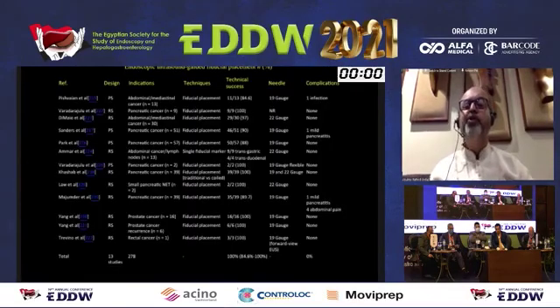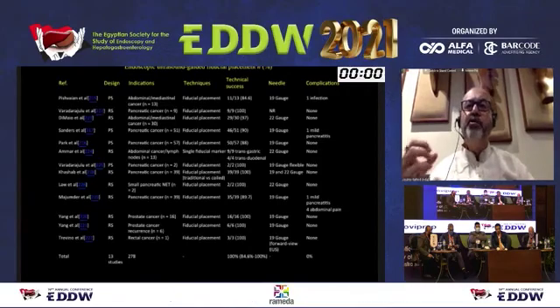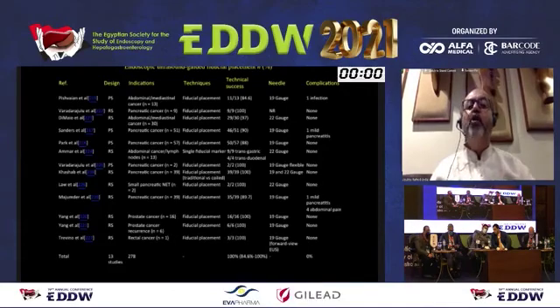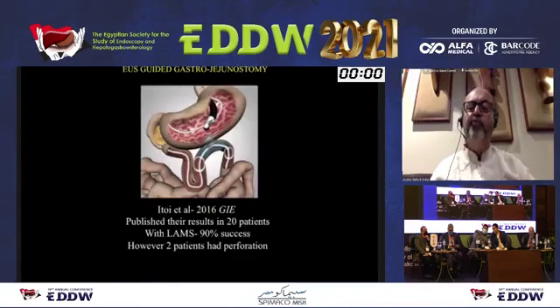Coming to fiducial placements, those cancer centers who are doing very specific radiotherapy can possibly benefit with fiducial placement, EUS-guided into the pancreatic tumor and targeted sites or even lymph nodes, and then guide the therapy. So this is an interesting area which needs a lot of study, which we don't have.